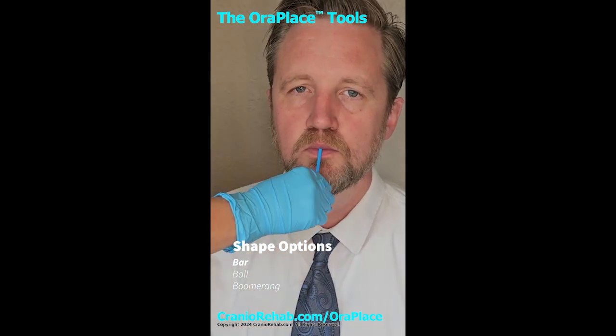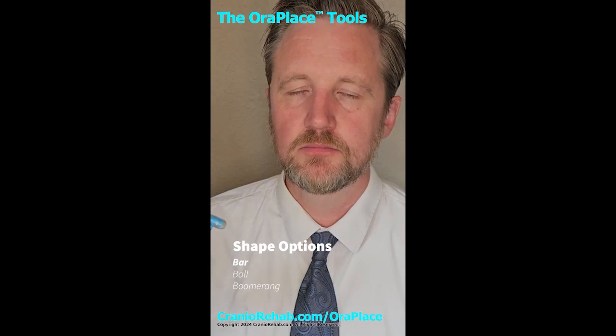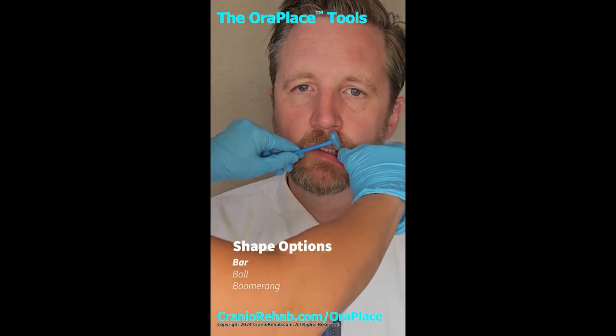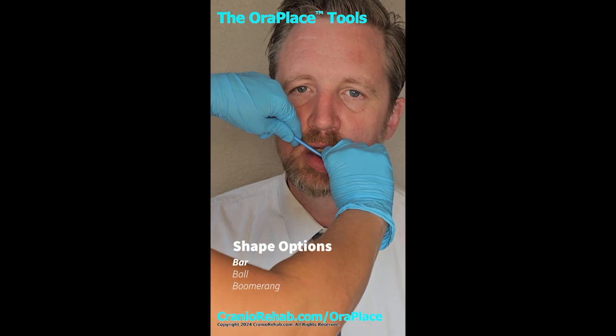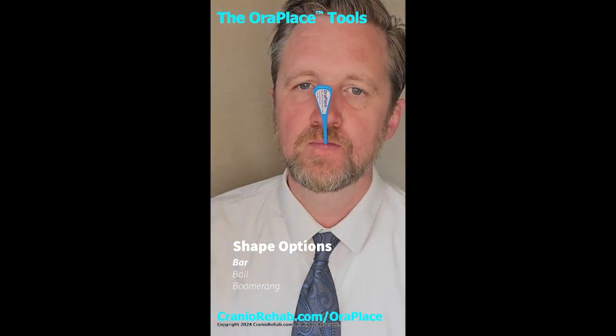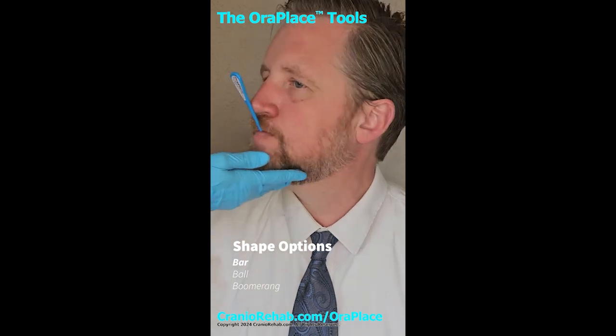Okay, moving to the lower lip area. If you have difficulty slipping in the tool, gently grab the side of the lip with your other hand and then push in the tool. Once in place, the stick may touch their nose, but again, you'll see the stretch here. So go ahead and turn to the side.